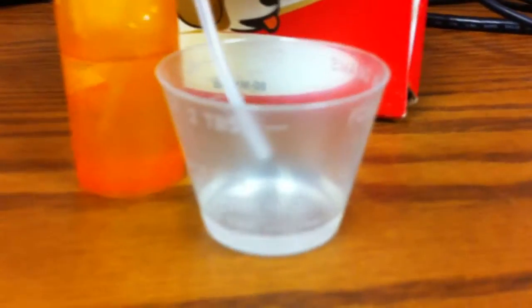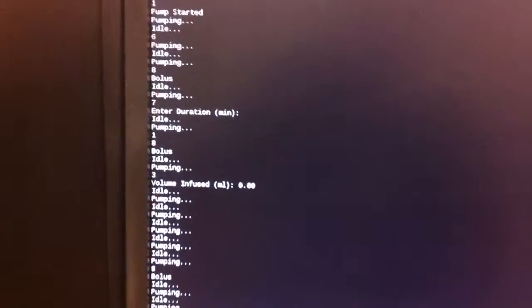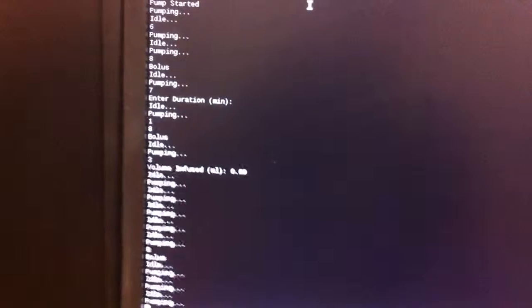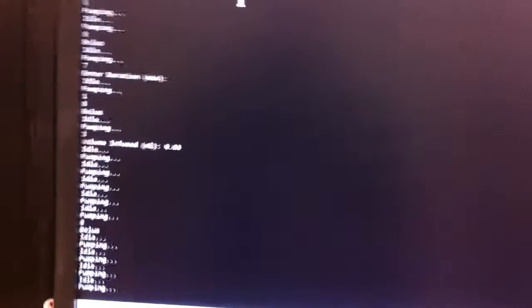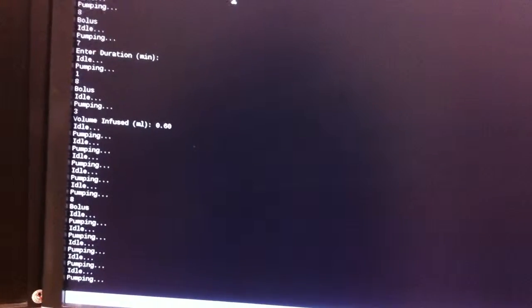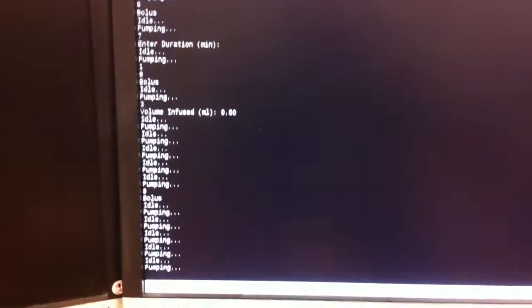You can see that a little bit of drug was already dosed. It's still working. I use 2 milliliters per hour as a maximum allowed drug dose per hour, and after 2 milliliters are infused, the pump should switch into KVO mode, which stands for keep vein open. This is a 1 milliliter per hour flow rate, which will allow keeping the patient's vein open when the patient is connected to the PCA pump.